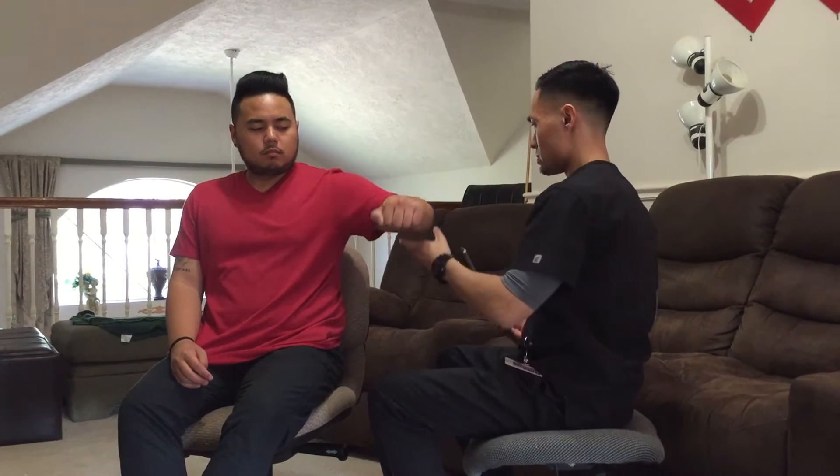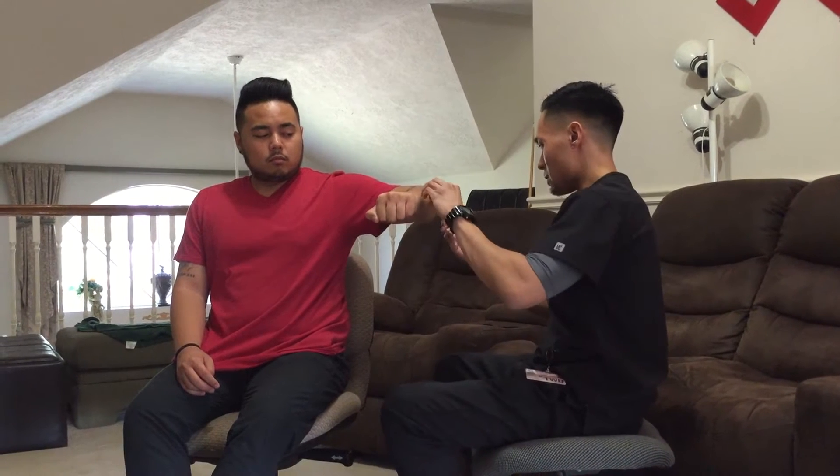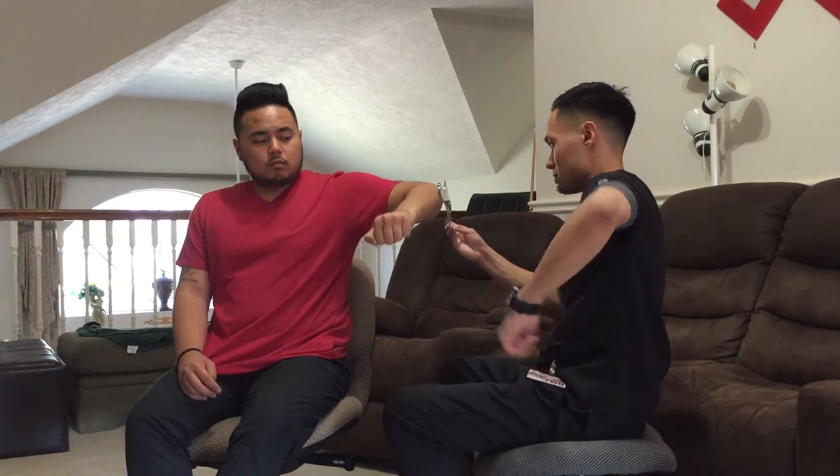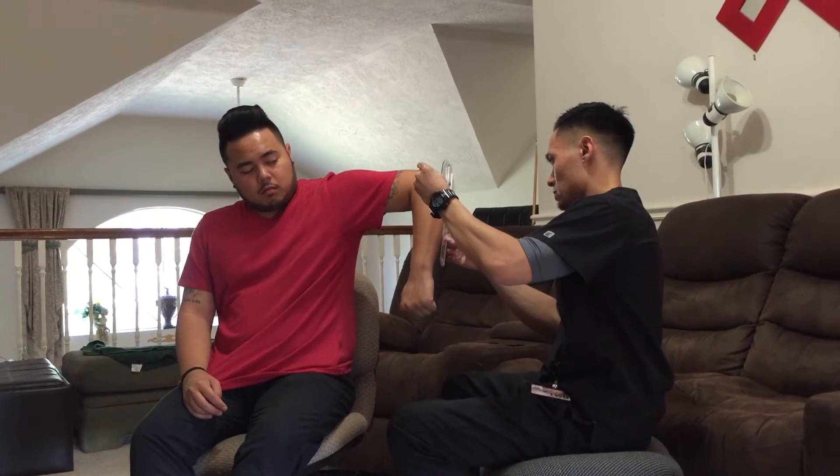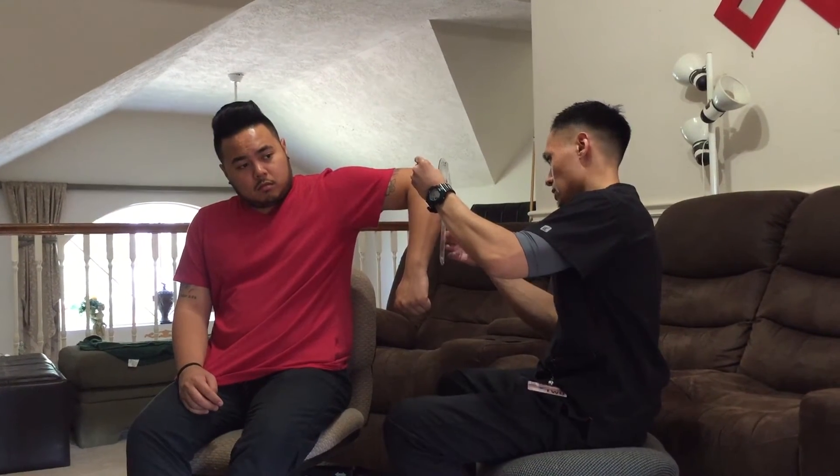Back to the position. Now this time I want you to bring your arm down. Okay, relax.